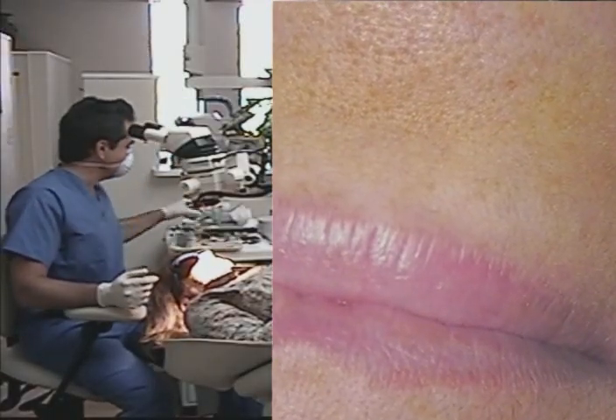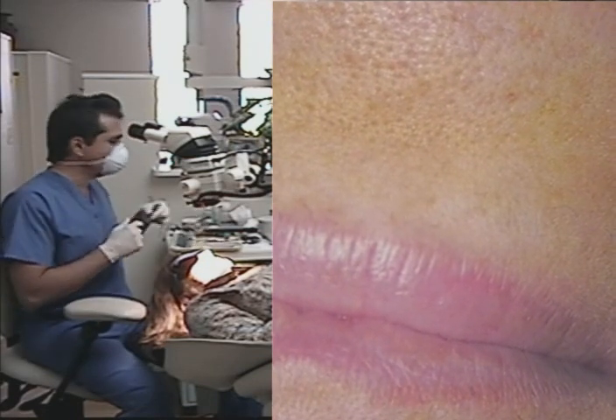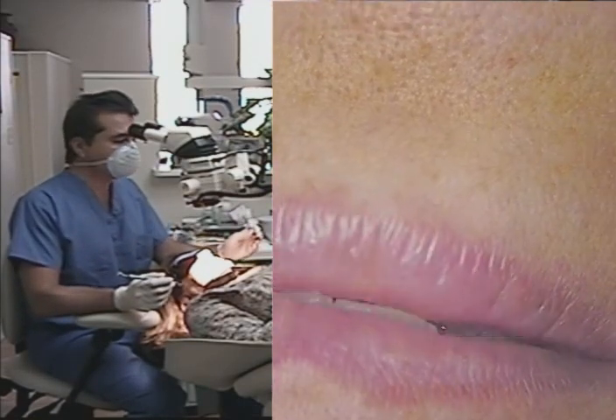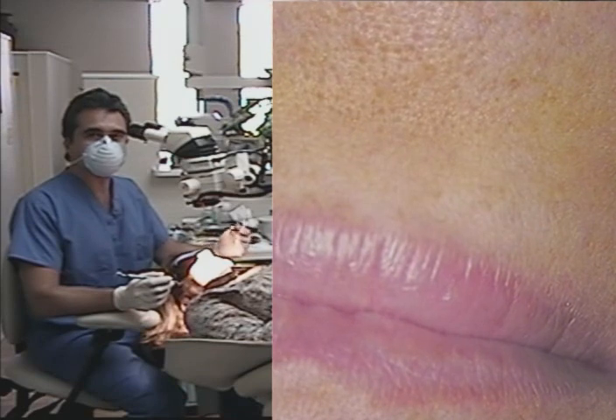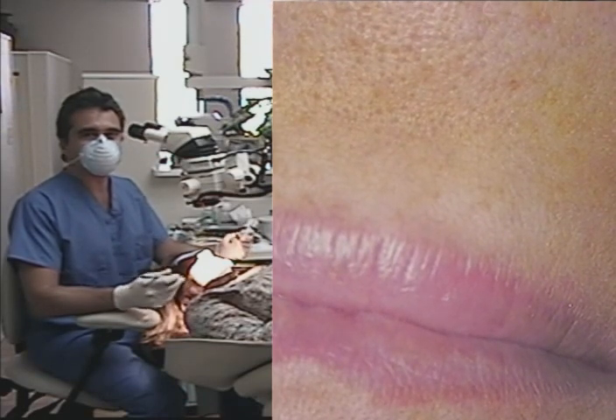The light's built into the microscope — you don't have to have a true light, though you can if you like. I'm going to start off using a very large mirror. When I teach the course, I like to use a large mirror because it gives the operator a chance to see the entire arch.